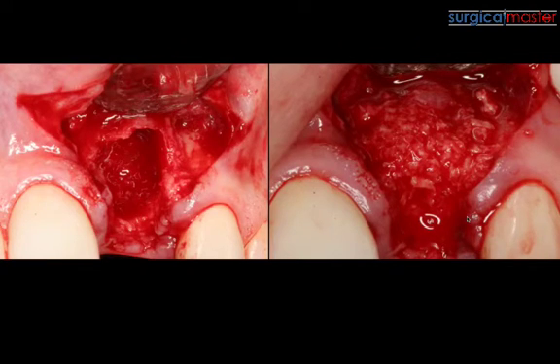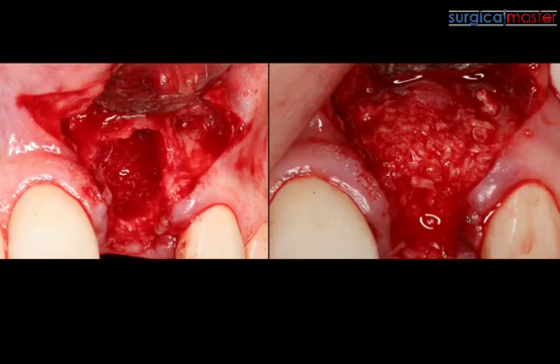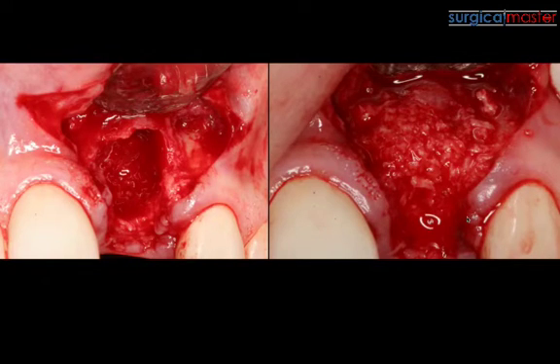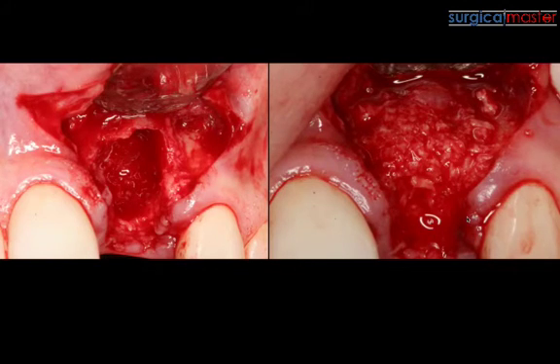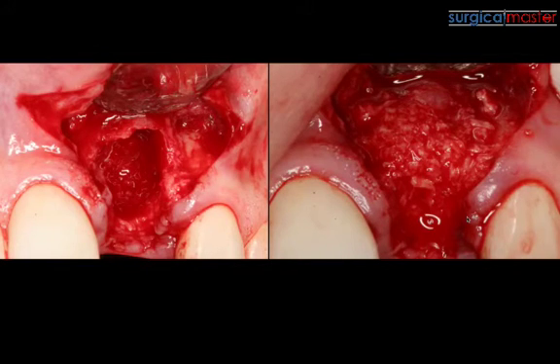Don't get overwhelmed by how it looks. Be very, very clear and methodical in your thinking. All it means is that you need to reflect the flap beyond the defect. You need to debride it—spend a good five, sometimes ten minutes to debride the socket, remove all the granulation tissue, and be in contact with the actual healthy bone.